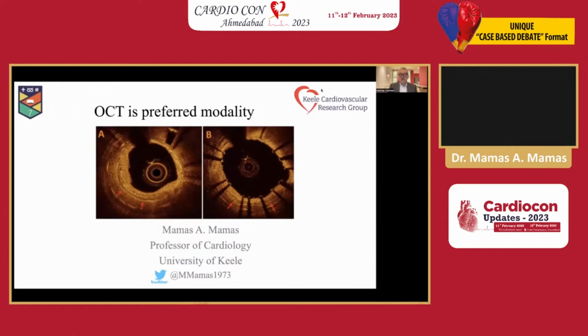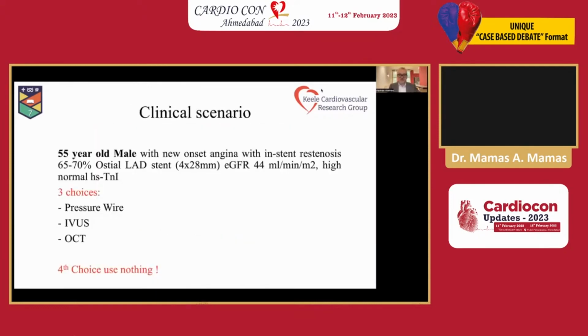Really, our discussion is going to be which of the three modalities is best for this particular case. The important thing to say in this debate is, of course, we're doing this from an academic perspective. Often one uses more than one modality in many cases, so I think there is an important role for physiology and imaging. But nevertheless, my remit today will be to try to persuade you that OCT is the preferred modality.